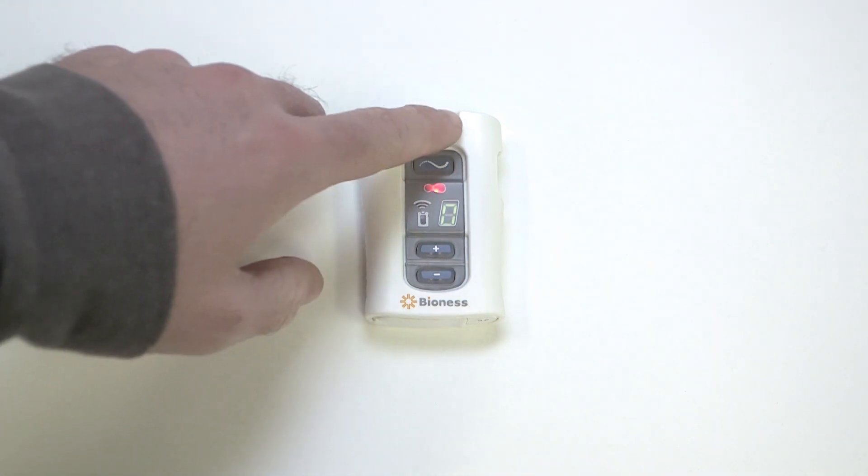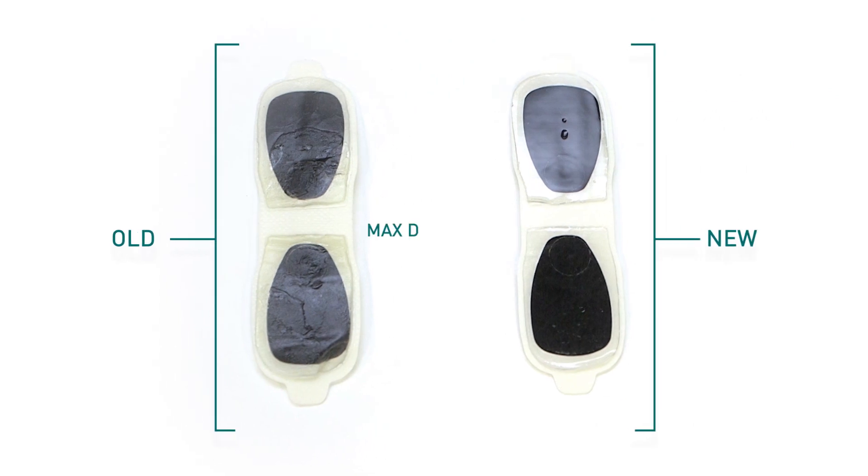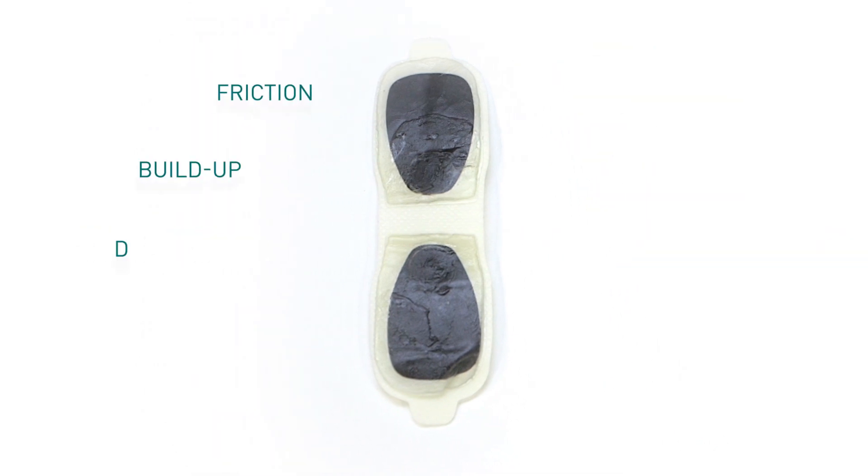Turn off the patient programmer. Make sure the gel on the electrode patch is in good condition. The maximum duration of an electrode patch is four days, but it could be less depending on factors that accelerate wear.